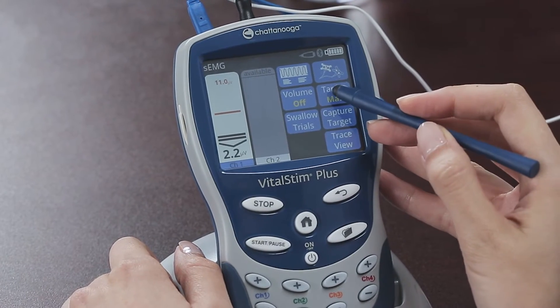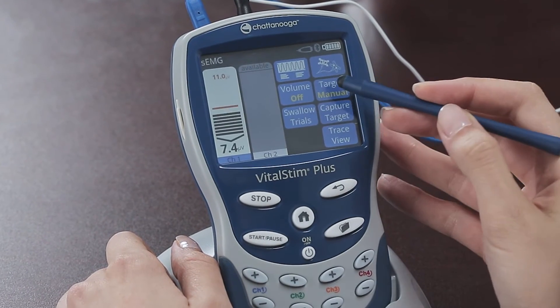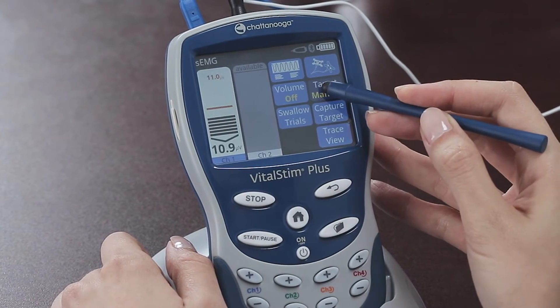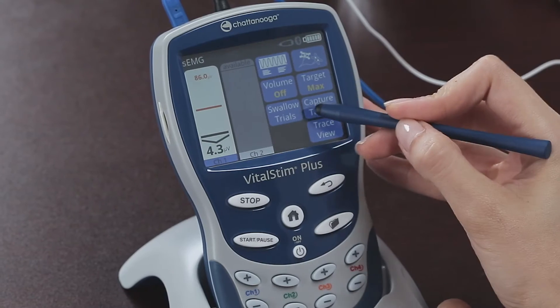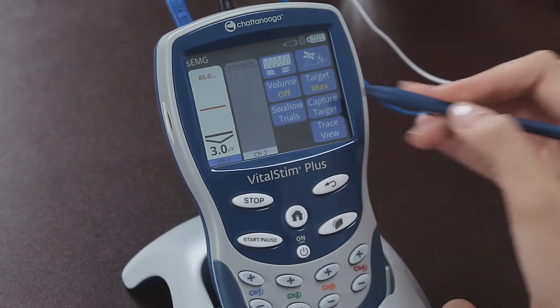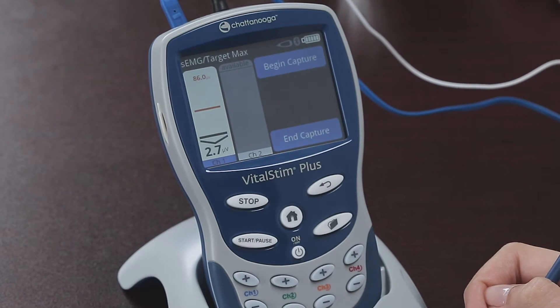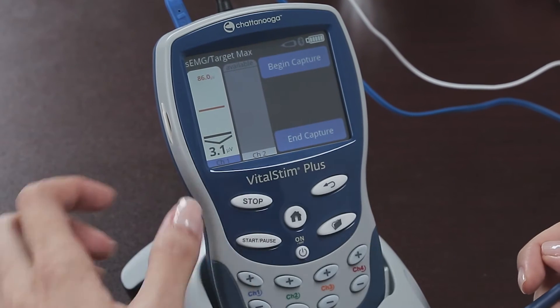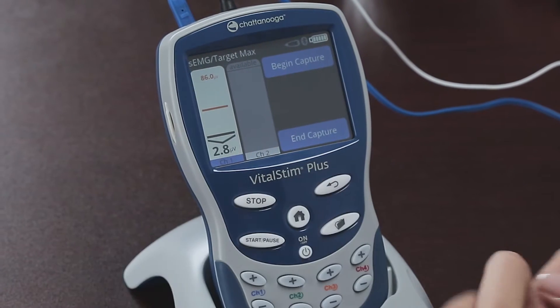The target can be adjusted manually or automatically. In target max mode, the automatic mode, pressing the capture target button will result in the unit recording several attempts of the patient and then setting that as the target level for the exercise.